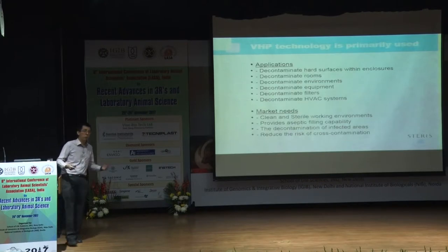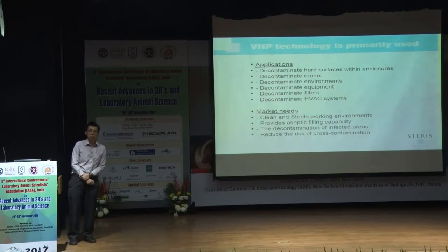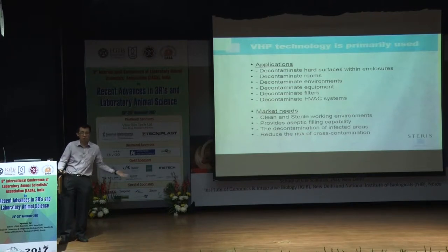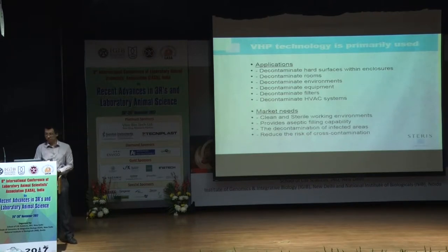So why do you want to use VHP technology? We use it to decontaminate surfaces, rooms, filters, HVACs, even HEPA filters. It's really good for clean, sterile environments, not to mention lab facilities as well.